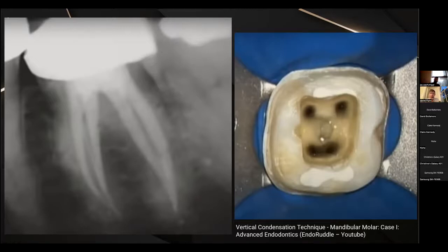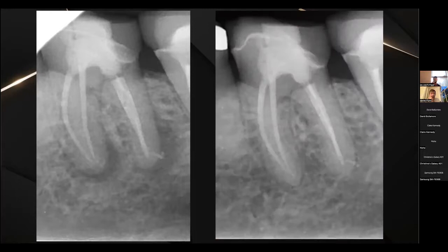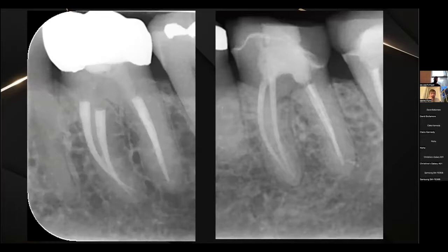So if you then compare it to something more recent, you can see on these mesials it's much more conservative. There's actually 2 distals there, so it looks like a wider prep, but again, they were very skinny preps, and this lecture would be quite useless if this treatment didn't work. Thankfully, at the follow-up, it has all healed, and in comparison to that first one, which I would have done a few years back, we've achieved the same result, being much more conservative.